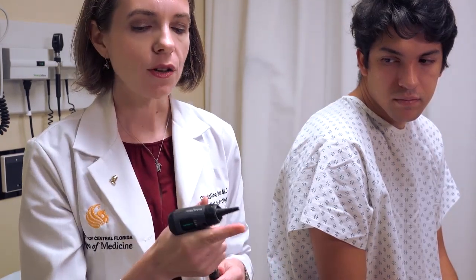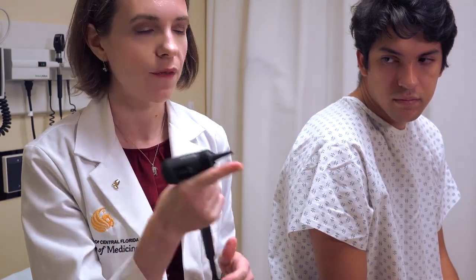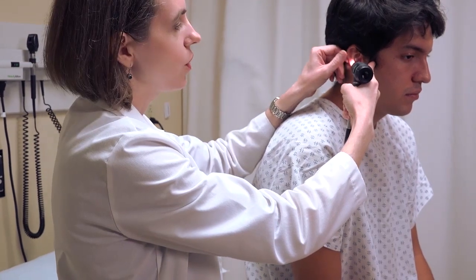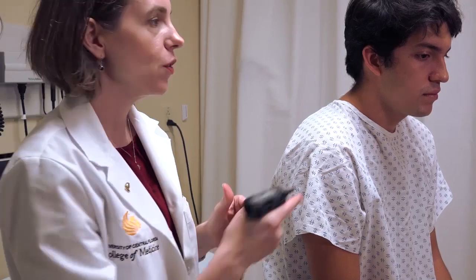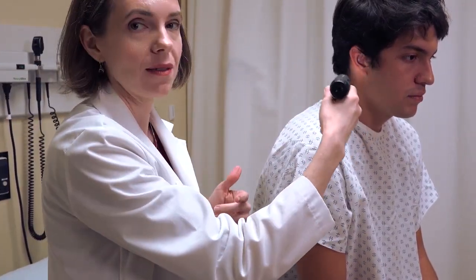Now, how to hold the otoscope. Most individuals hold it upright — you want a good hold of the base but also near the head for good control of where it's going. I recommend pointing out a finger, either your index finger or your pinky, something you can rest on the patient's face so that you are anchored to the patient's head. If the patient moves suddenly and you don't have any anchor, they'll move and the otoscope will stay in place — the tip of the speculum could then hit the inside of the ear canal and cause pain or even bleeding.